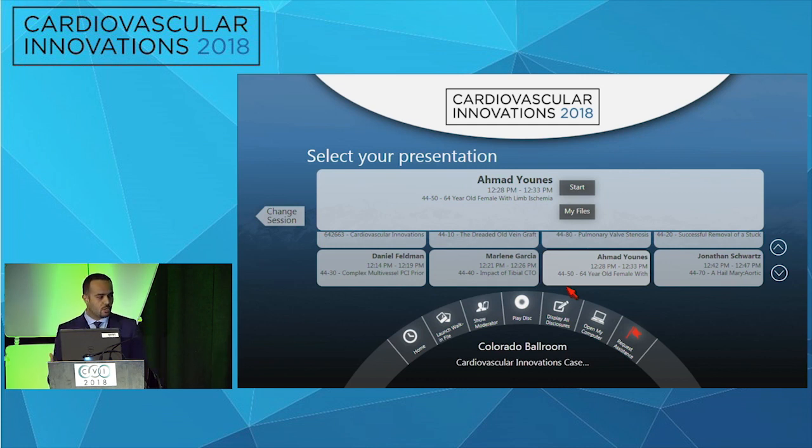Having a vascular team, early conversations with the vascular surgeons, try to avoid unnecessary delays in the patient care. This case was a late evening activation. When the patient started having worsening lower extremity pain requiring narcotics, we decided to take her straight to the cath lab. Intravascular imaging, I think it's mandatory now to delineate the mechanism of failure and really understand and have the accurate sizing and measurements if you want to put some stents in there.